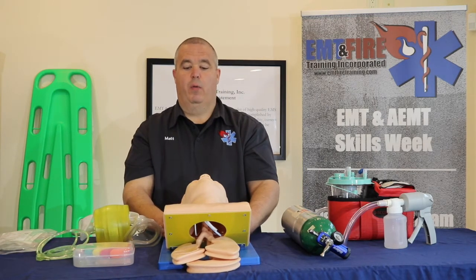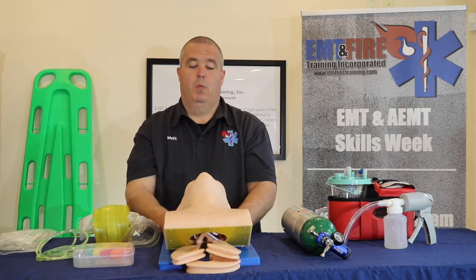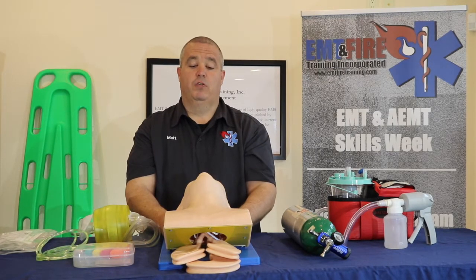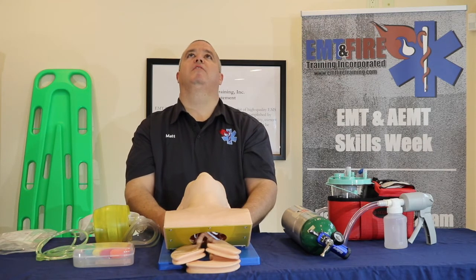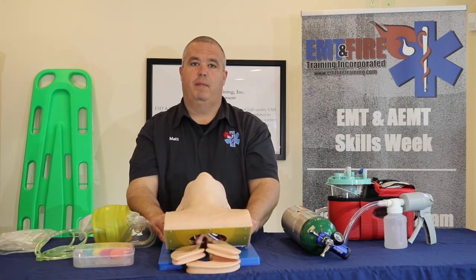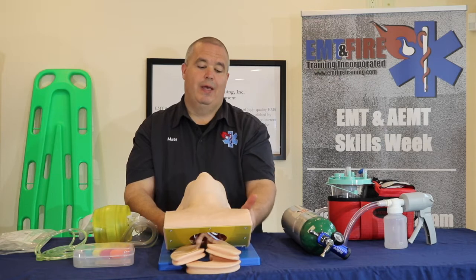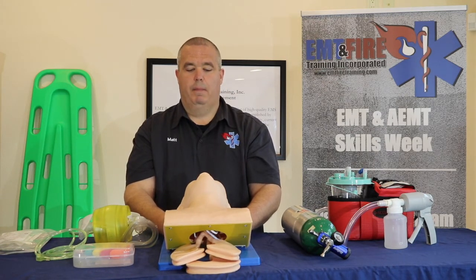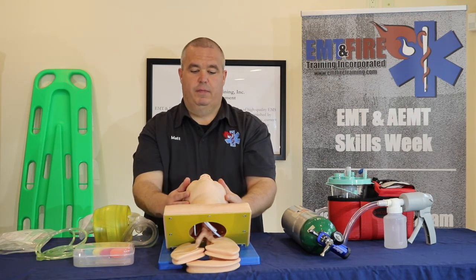The gold standard, the best way to open an airway, is the head tilt chin lift, where we really crank their head back as far as it can go. This solves two problems: it gives us a better shot into the trachea, and it actually closes down the esophagus, which limits oxygen getting into the belly. If you are by yourself — even if you are worried about cervical spine stabilization — we're still going to do the head tilt chin lift, because we need to get oxygen to this patient's lungs. You cannot do the jaw thrust and ventilate at the same time by yourself.